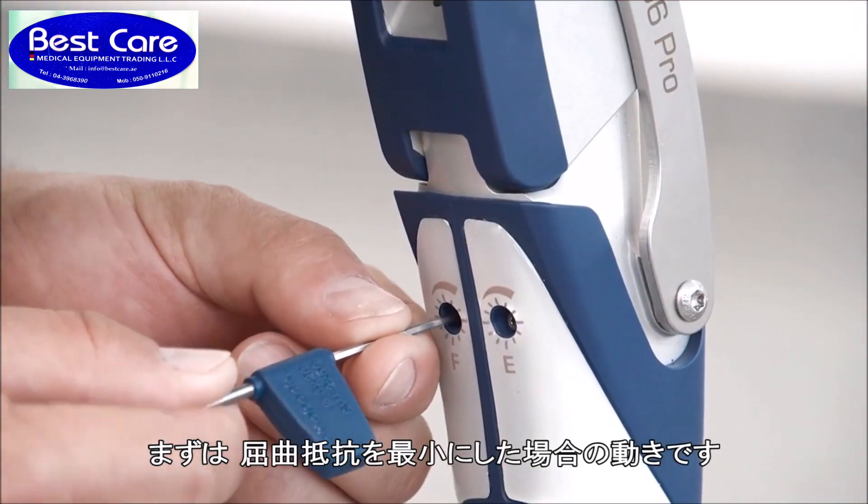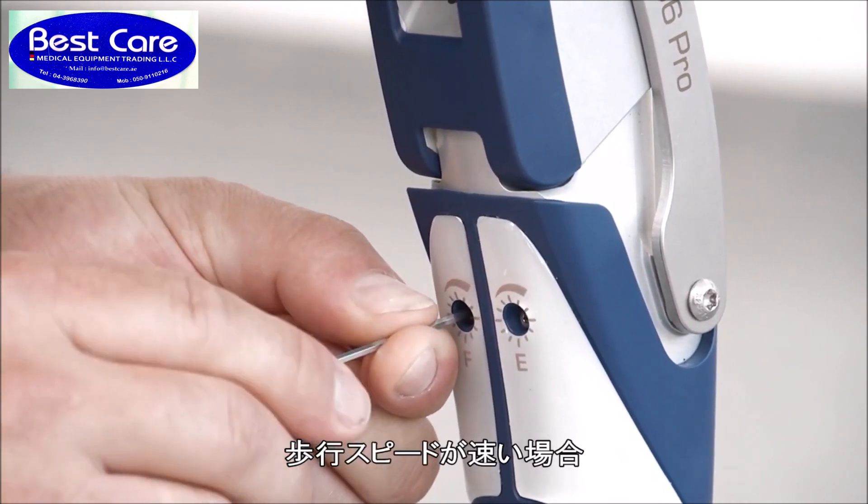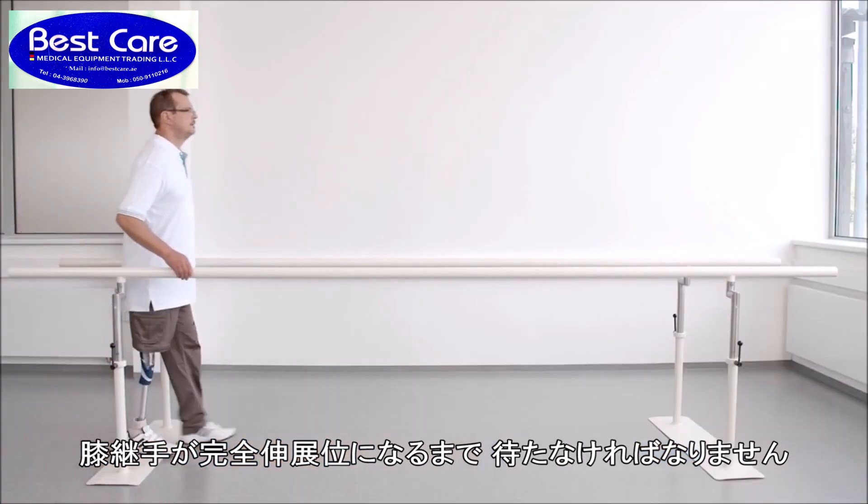At this point the flexion damping is shown at its minimum. At higher walking speeds, the user has to wait too long for the prosthesis to reach full extension at heel strike.